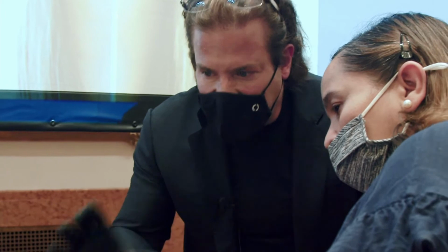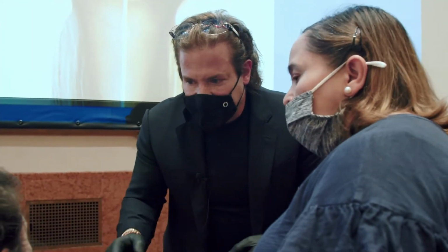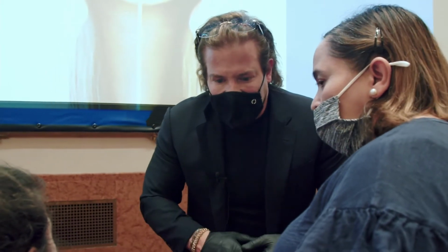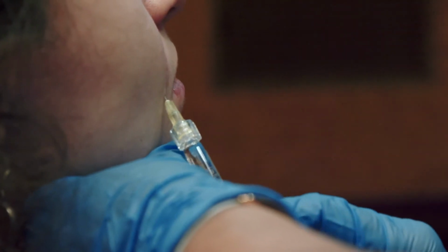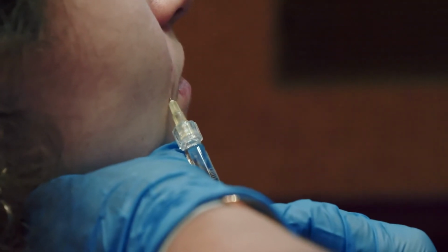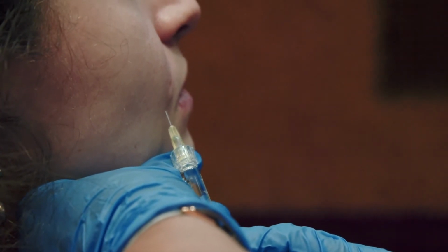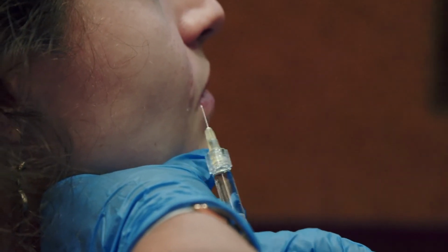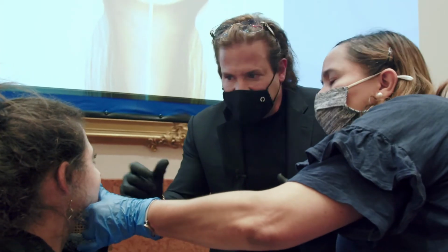And the depth is also very important because your blood vessels and more important structures are deeper. So you want to be into the dermis, which is where you're at. So you're doing fine. And kind of put the needle down. Yeah, that's it. Good, okay. All right, now stop. You see how it came out? Technically, they say you could get a track, so you don't want to continue injecting as it's coming out. Right before the needle comes out of the skin, you want to stop injecting.